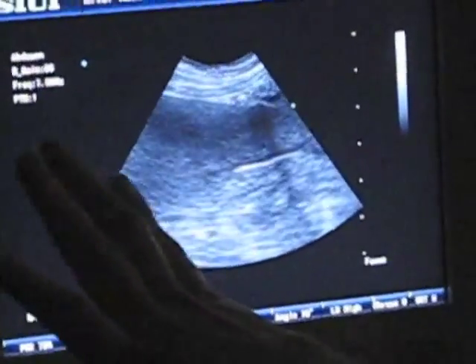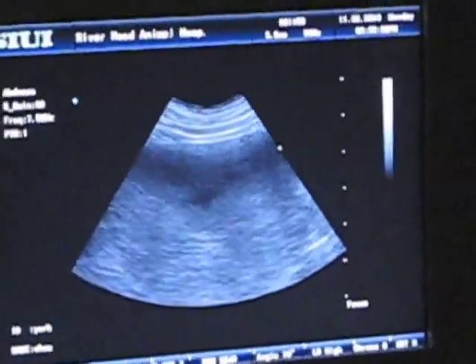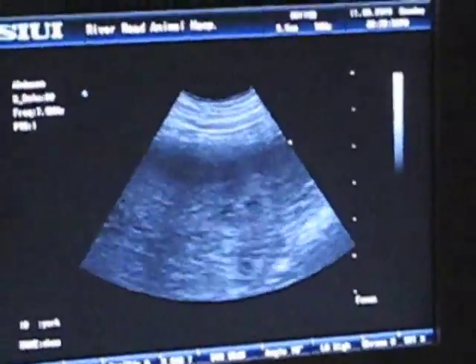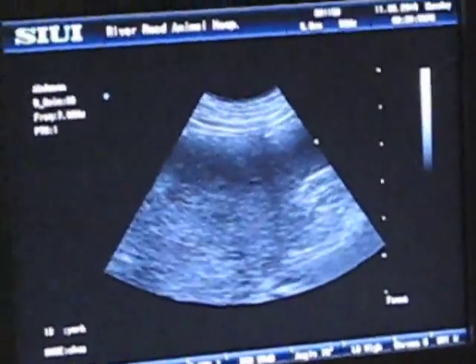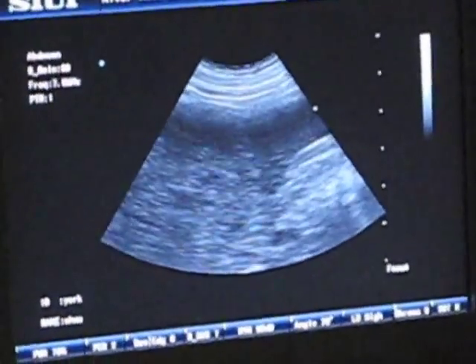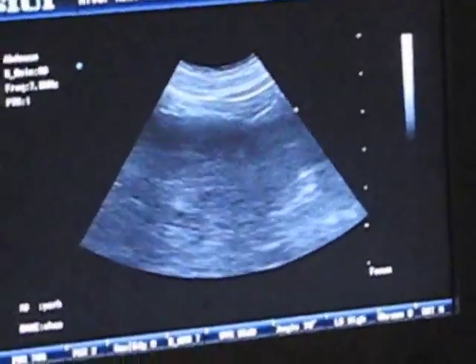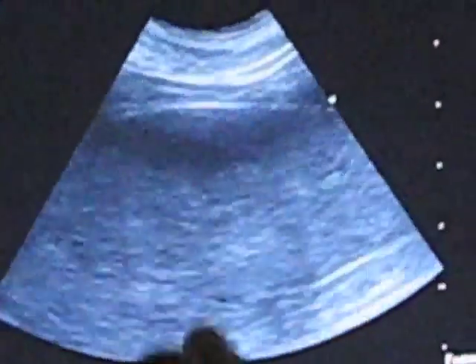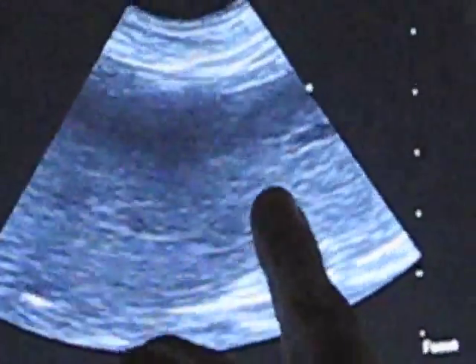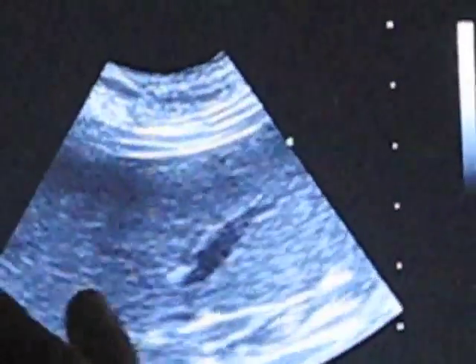Now, you can also look at the architecture. It's nice and smooth here. When we go down here, this is starting to look like a tumor to me. It's kind of — it might be hard for you to see — but it's kind of got all these little black circles in it. Those are little blood vessels feeding it. So normally we shouldn't have any little black specks in there. Up here in the healthy part, those are blood vessels — you can see them going through, like a normal blood vessel that feeds the spleen, and it's very smooth.